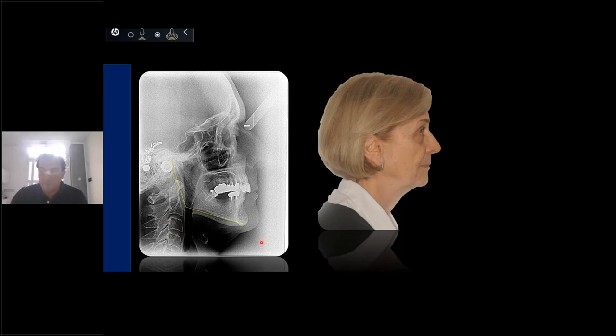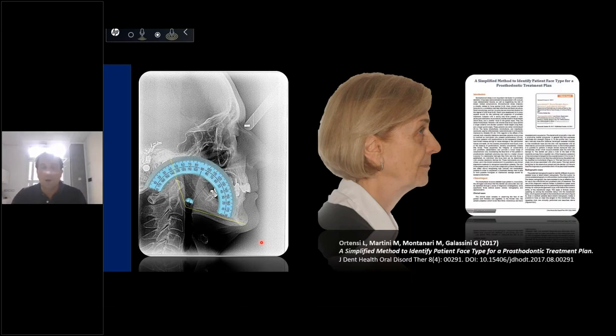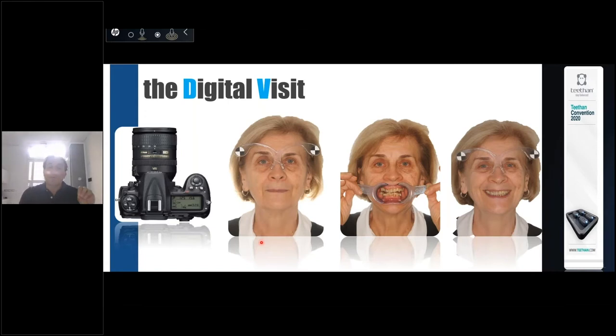After this first part of the visit, where I do a cephalometric exam of the patient, I take some pictures of the patient. I take pictures at the first visit because I want to know if I can help the patient, and I want to share with her some information about the future of the setting, not the function. I follow this type of exam after a few minutes, after these photos, when I take the exam with the Teethan.